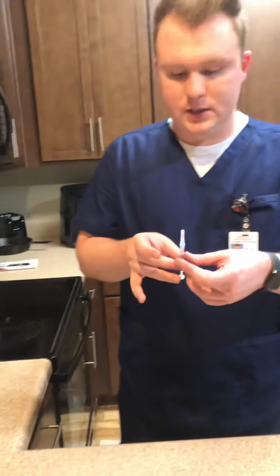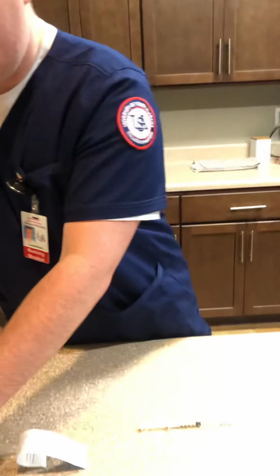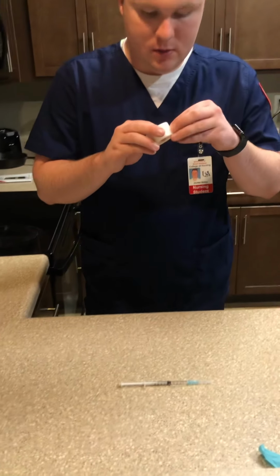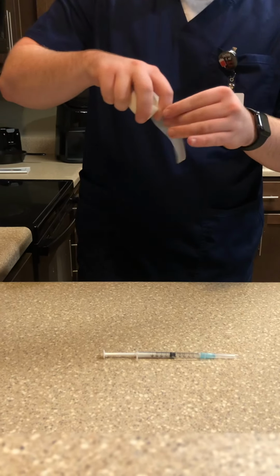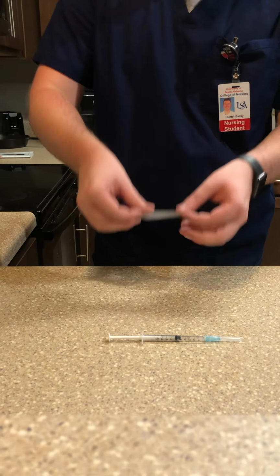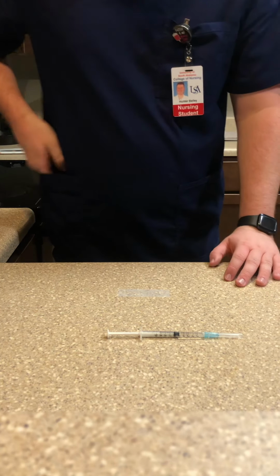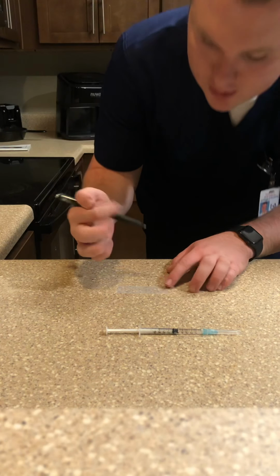Now I'm going to set my medication down on the table. I'm going to move my trash over and get my tape. I'm going to prepare a label that has the patient's name on it, the drug and the dosage.